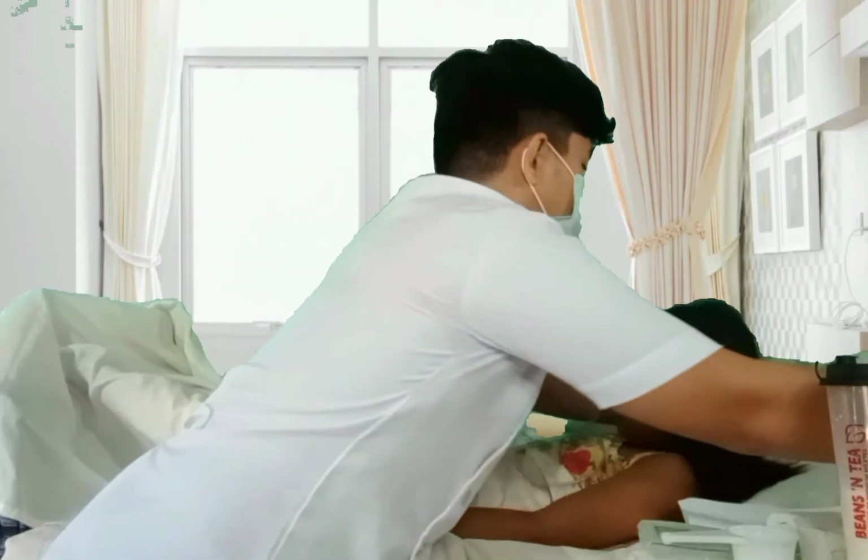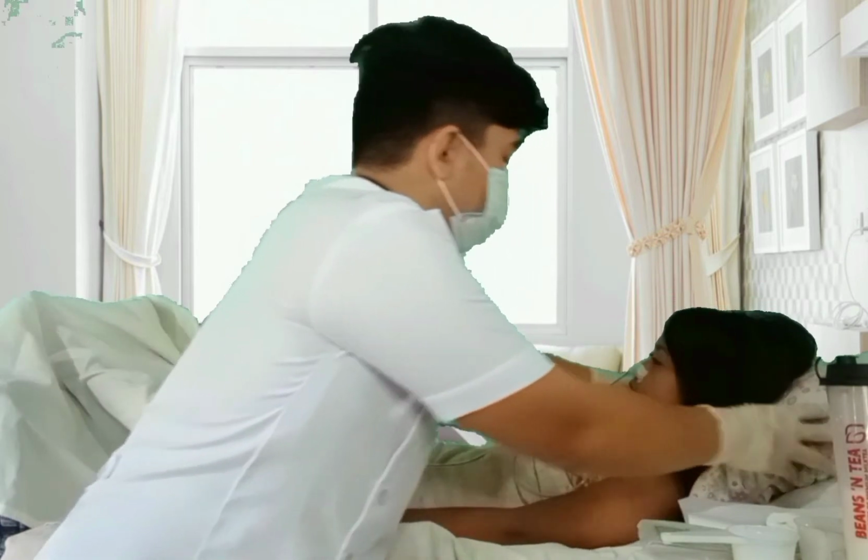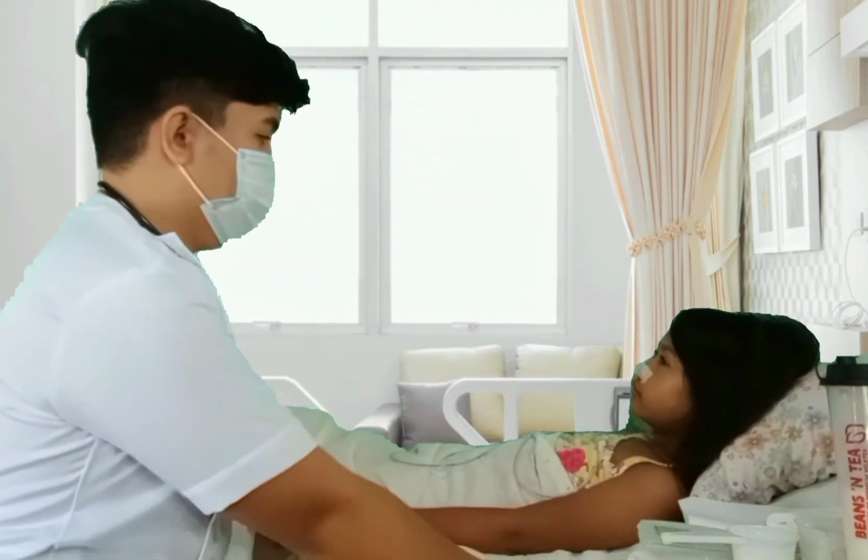Step 4. Place client in high Fowler's position or elevate head of bed 30 degrees. Elevated head helps prevent aspiration.